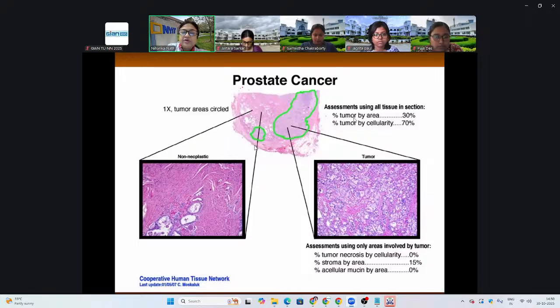So these different components and constituents that are present are all the stroma. So everything, all that your tissues have. Some of them are ducts. Here, some of these are ducts. So this is a duct and this is a lining of the duct.